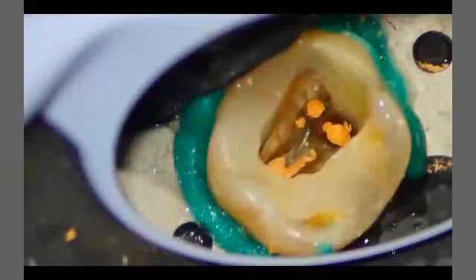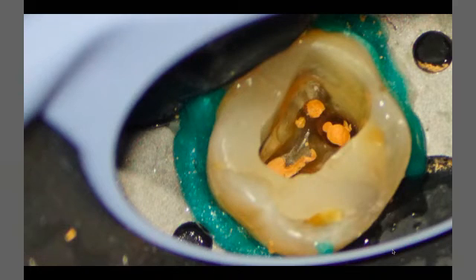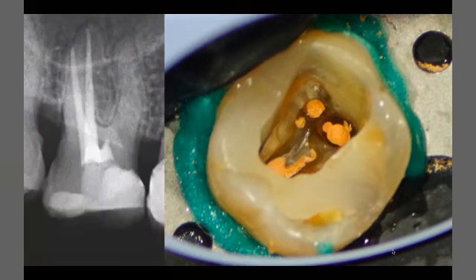Yes, this one. If you see this axis and the data for MB1, MB2, buccal and palatal, you will see that everything looks great. But according to the X-ray, you can see that we have a missed mesial root because of calcification.